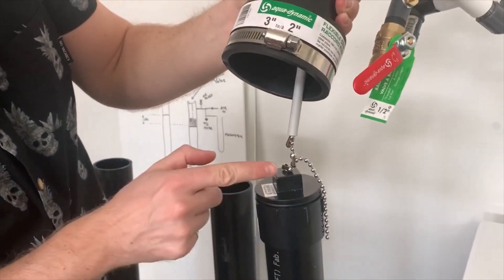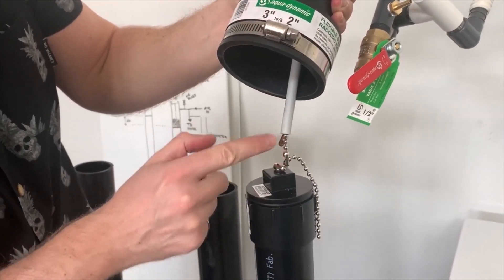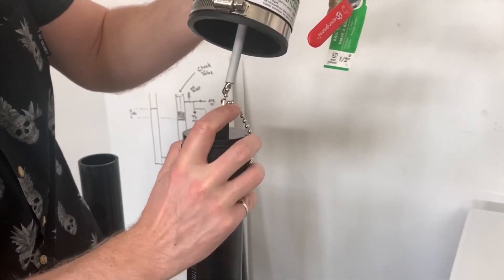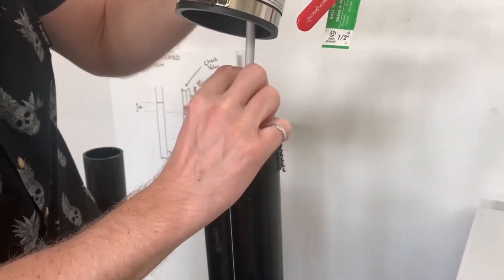Here's the float. You can see I have the chain set to be a very short length right now. The height difference is the travel of the valve plus the length of that chain.